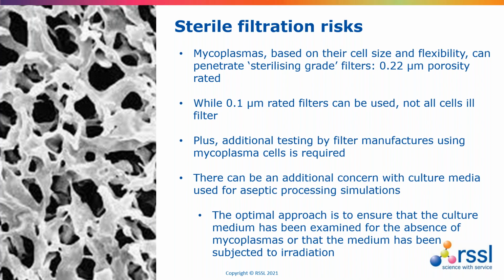And it would be hard to detect this because obviously if we're looking for bacterial contamination and we had non-sterile culture media, we would probably see all of the media go down with turbidity, but that becomes more complex when we have concern about mycoplasma. So again, it's about purchasing the media from reputable suppliers or irradiating the media beforehand.